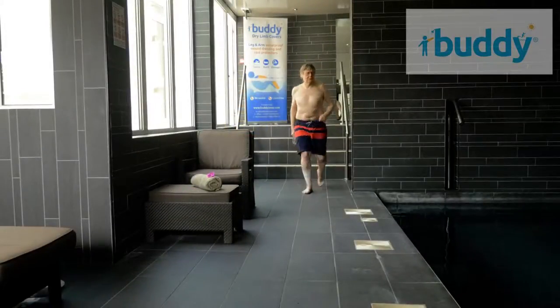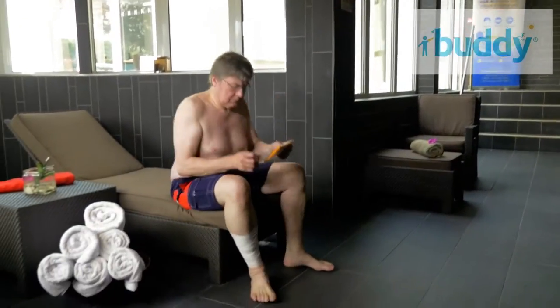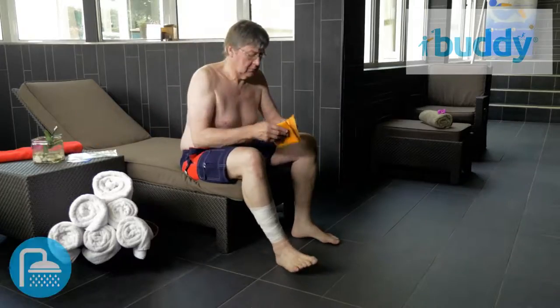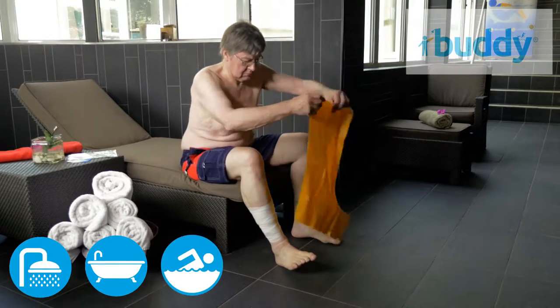Manufactured in the UK by QOL Limited, standing for Quality of Life, Buddy watertight reusable covers are designed to keep bandages and plaster casts dry and allow you to shower or bath in privacy and even swim.